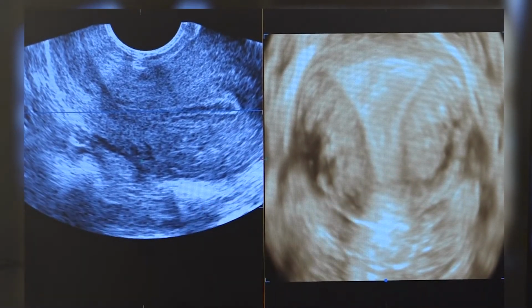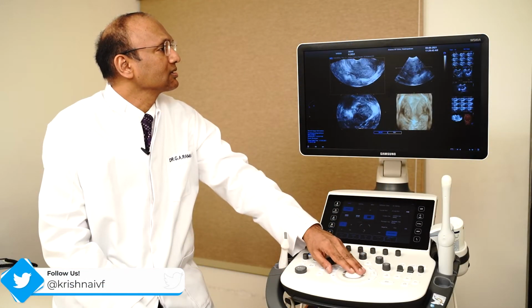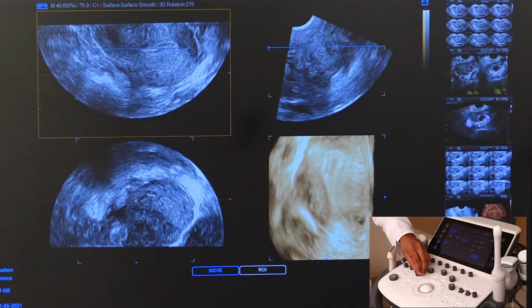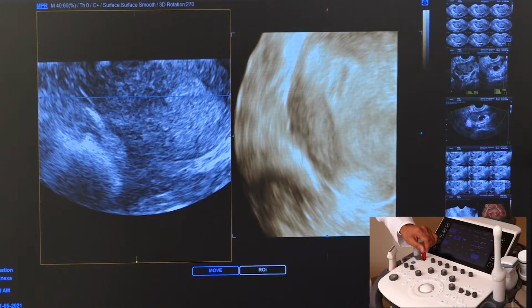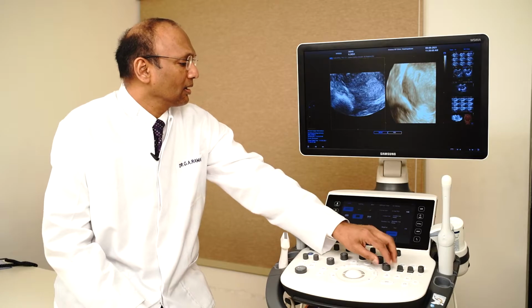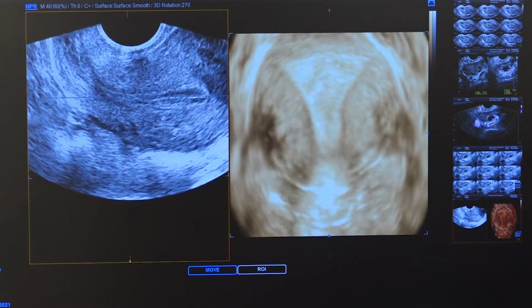This image you can make it into 4 sections, and then you can adjust the image in different sections so that you get the different pictures. You can also rotate the image to get different images and then adjust the gain so that you get different images. Then you can go back to the original image and then adjust it.